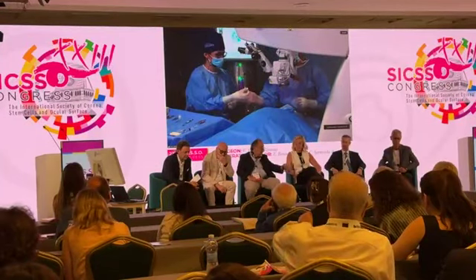Just some hydration of the port side with antibiotic, then the surgery is done.